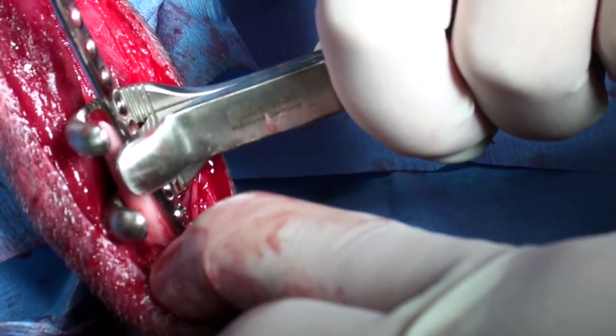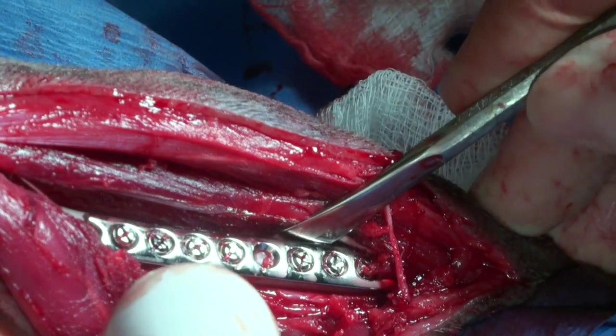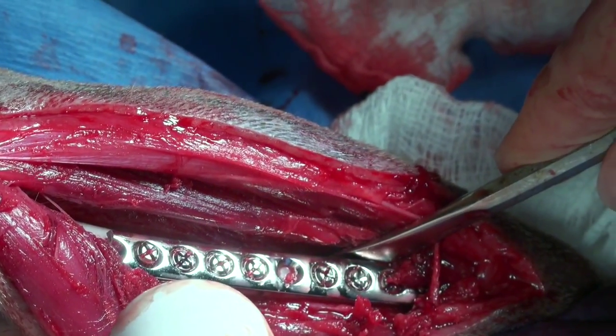Now we just need to keep going, drilling holes and placing more screws. We've finished the plate. The fracture is not completely reduced — this is how it looks.